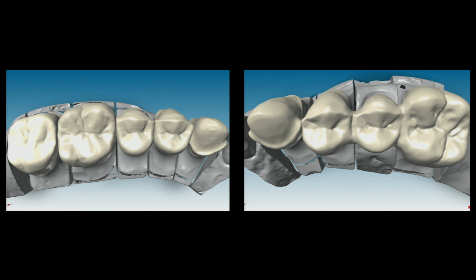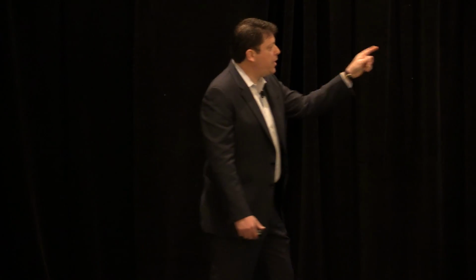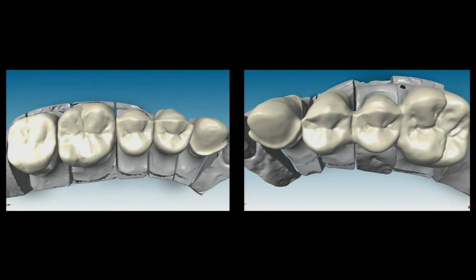So the technicians here, in this case, from CASP, Masaseto and Nori Kajita, you can see here the design of the molars is monolithic. The design on the canines is bilayered, and on the bicuspids, we have what I call a hybrid design. The areas subjected to occlusal load, the areas that are not aesthetically important, are monolithic, whereas the facial area that is important in terms of aesthetics is cut back, and we have that framework type of design there to allow for space for the veneering porcelain.